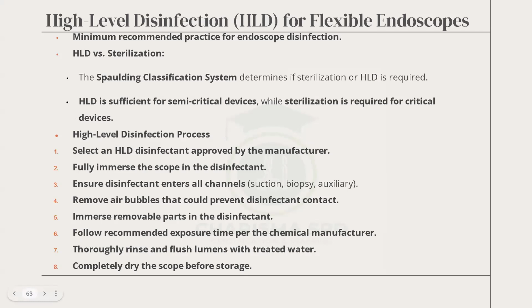High-level disinfectant. So you definitely will use some chemical, some solution of some sort to be able to do high-level disinfection. High-level disinfection is the reason why endoscopes are very, very infectious, okay? Because you cannot guarantee that it was really disinfected. That is why most of them, when you do high-level disinfection, after 7 days, depending on the hospital protocol, have to be disinfected again, because they feel that the chemical has expired.